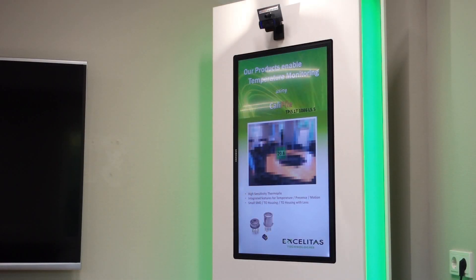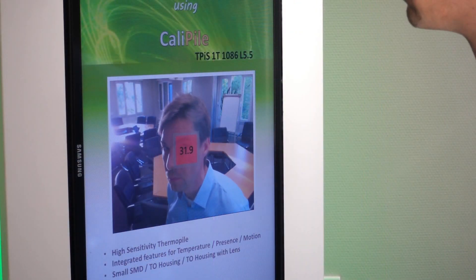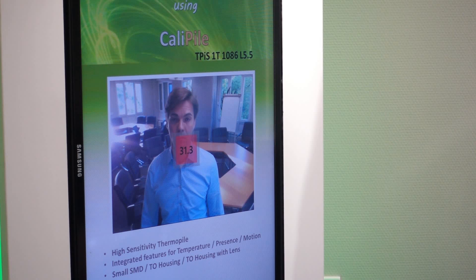Equip the sensor with a lens hut and align it with a camera. That way you can display to the person where exactly a measurement is being performed, which helps a lot to understand the measurement result.